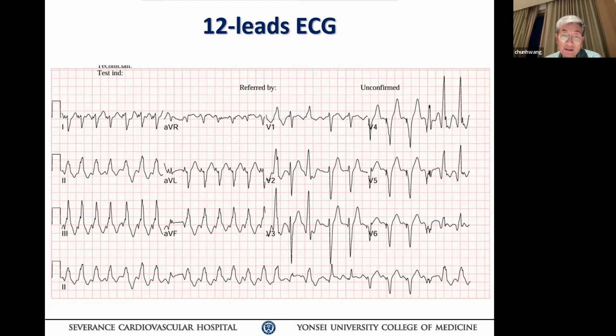And the second beat is the narrowest one, because you can see the second beat in V2, a precordial lead. At V1, V2, you have a very narrow complex. So I see 4 different types of QRS here. And I think we better explain this. Think about it, make a differential diagnosis before you guys move. Okay?